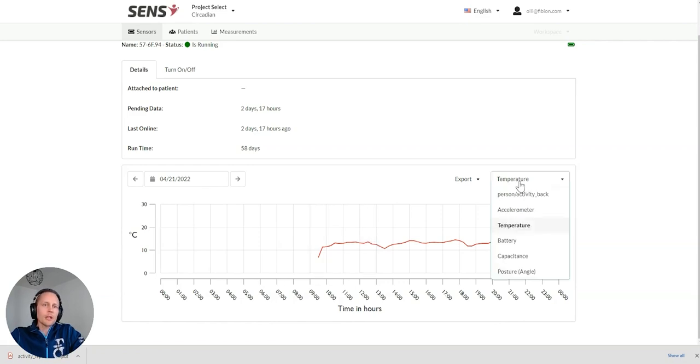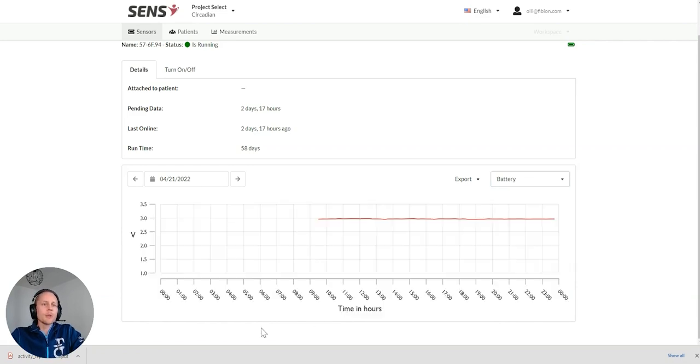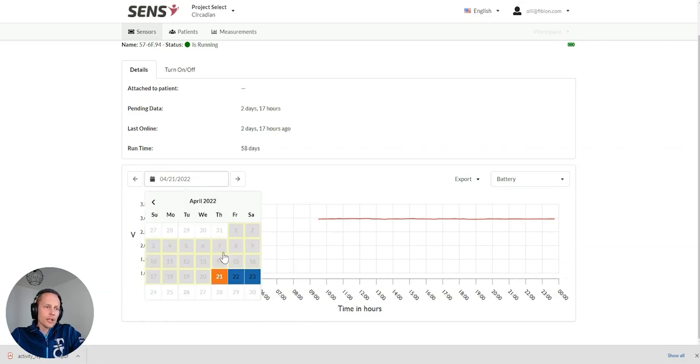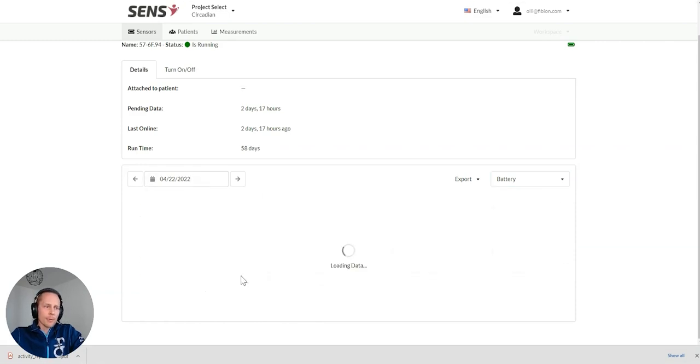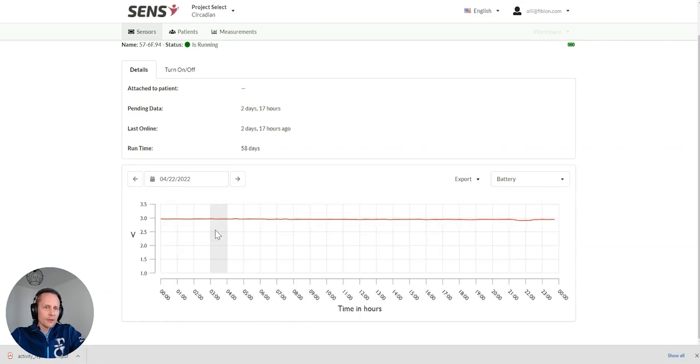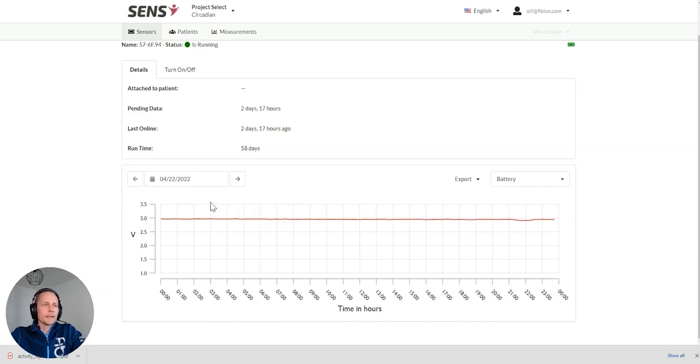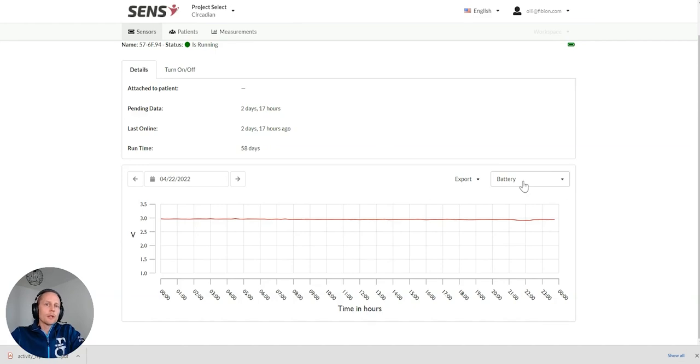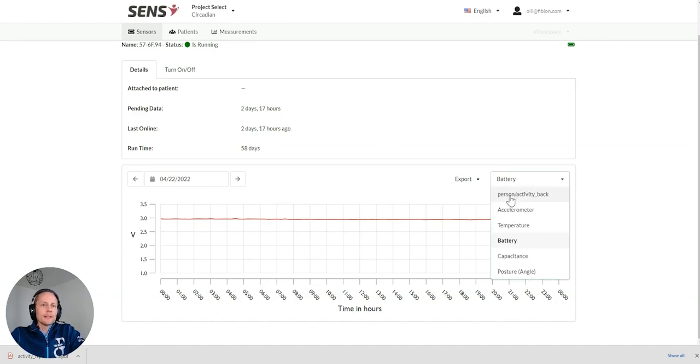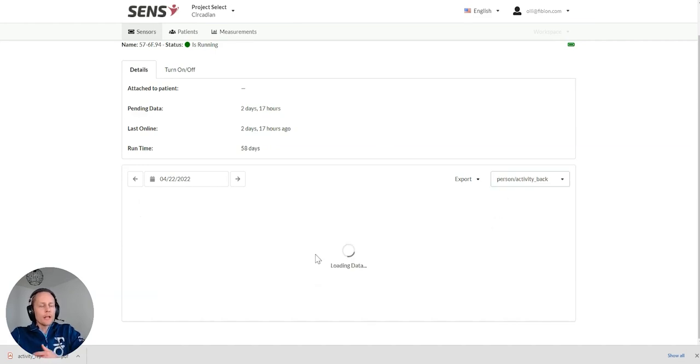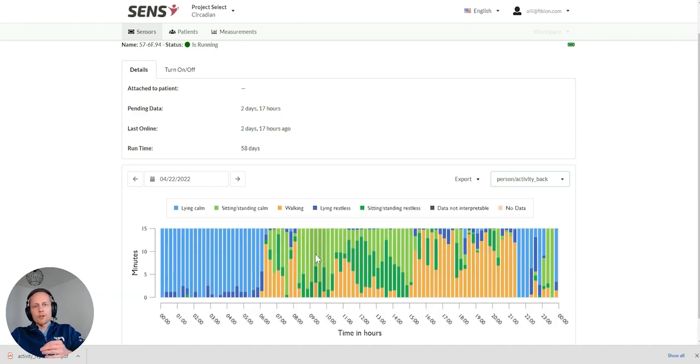It can give some indication of where the person is context, but usually not important information. And we can also check what is the battery stages of the device when it starts to drop. We can see it there. So, very easy way of measuring.